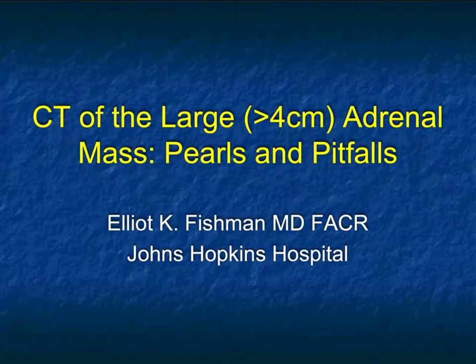The adrenal gland. In the past year, I've done several additional talks on the adrenal gland, one focused on the incidental adrenal lesion, the smaller ones, the adenomas versus other tumors. We spoke about some of the ways we distinguish and diagnose adenomas, the success of CT, and also spoke about some of the various other tumors.